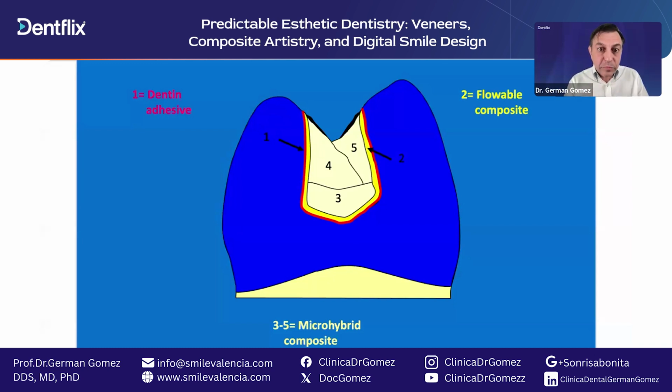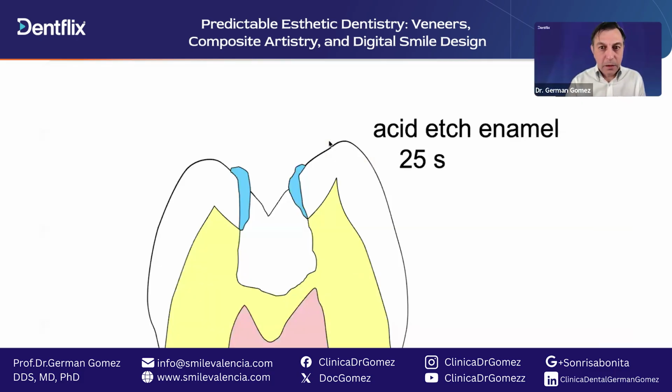Then we do, number one is the dentin adhesive, and then a flowable composite as a liner. That reduces the stress a lot. And then we do 3 incremental layers so that we get to a good final occlusal and contact area.